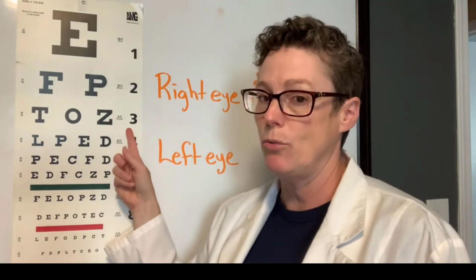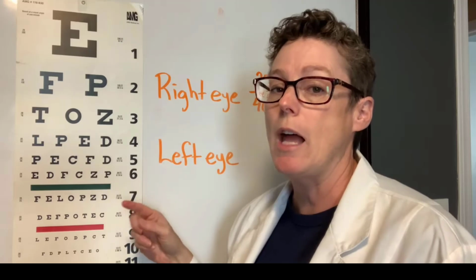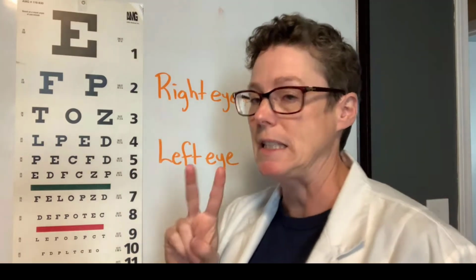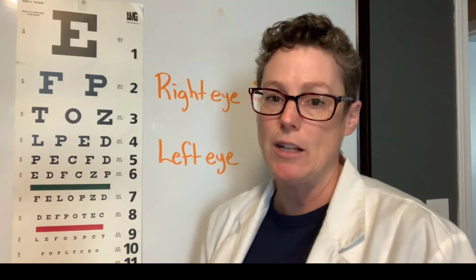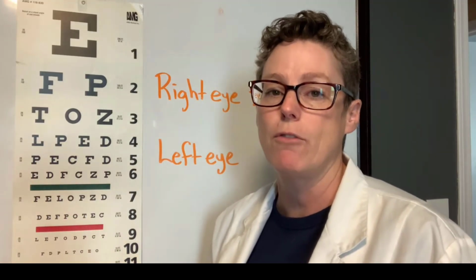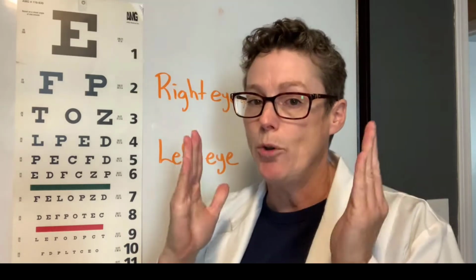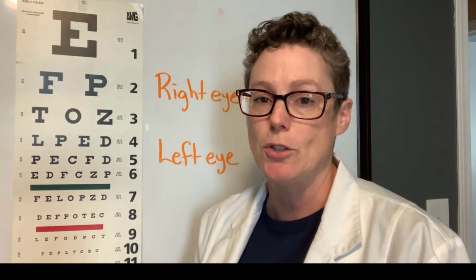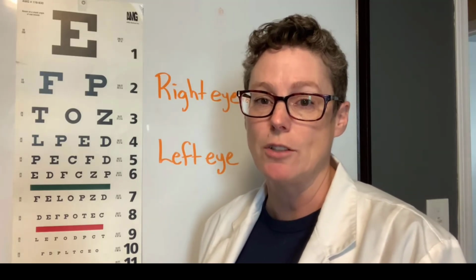You can start at line 3, and then you can skip to line 5, or you can have them read it backwards. That's the second tip, is to go to line 4 and read it backwards. And that helps you to ascertain that what they're reading is authentic for their vision. Then of course, once you've done the left eye, you want to do both eyes together so you have the full picture, and that would be your visual acuity assessment done using the Snellen chart.